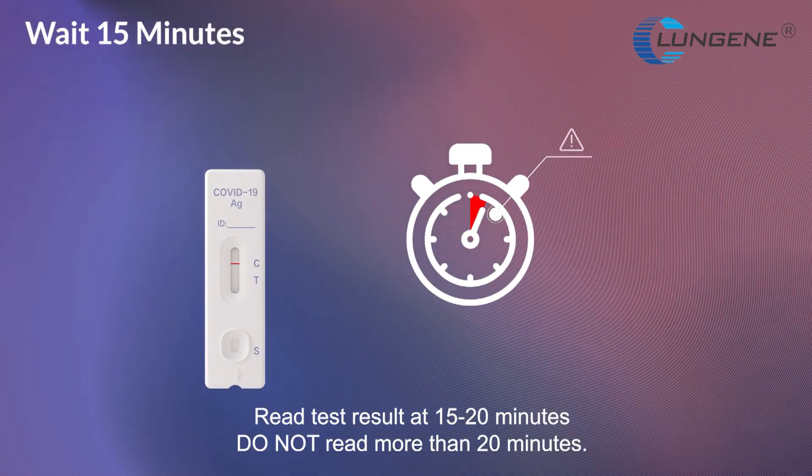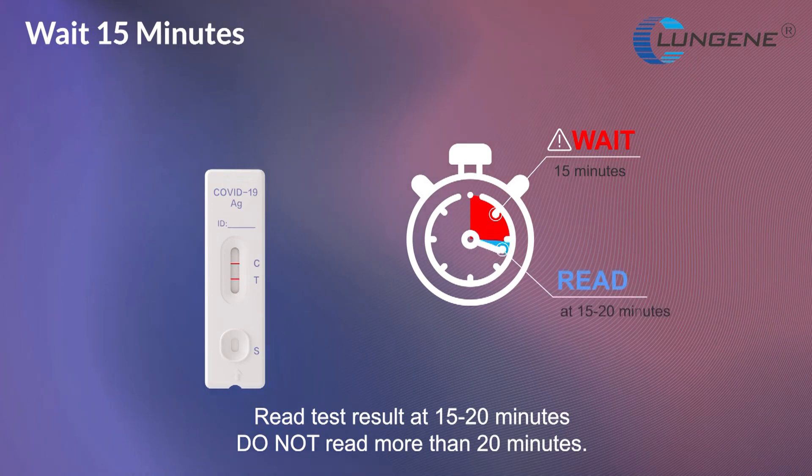Read the test result at 15 to 20 minutes. Do not read the result after more than 20 minutes.